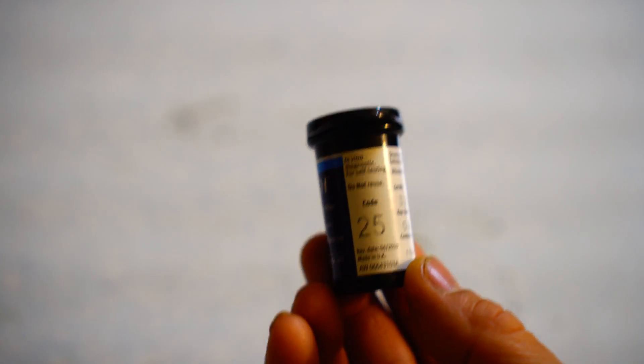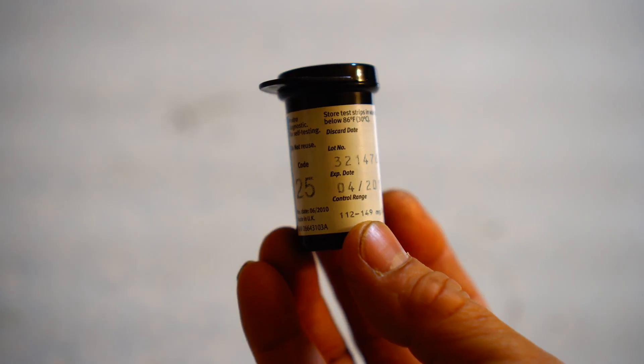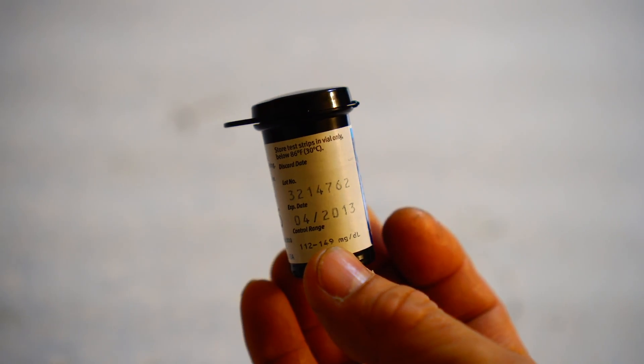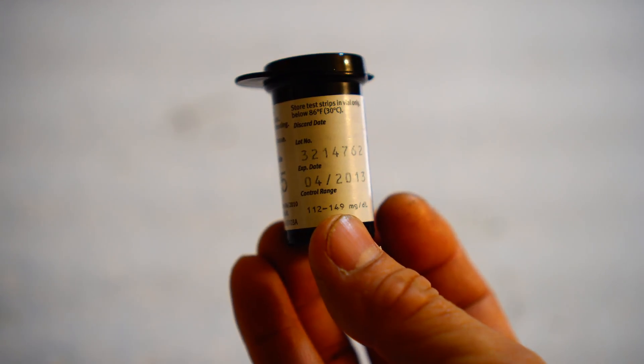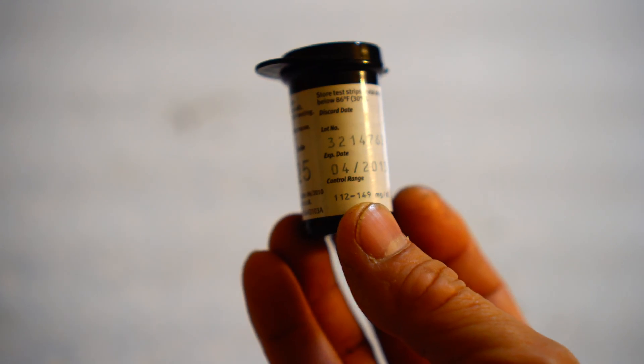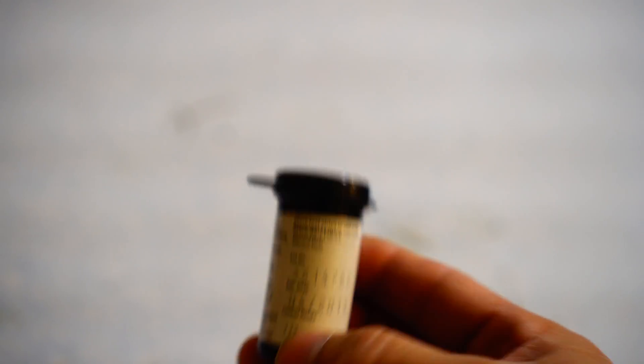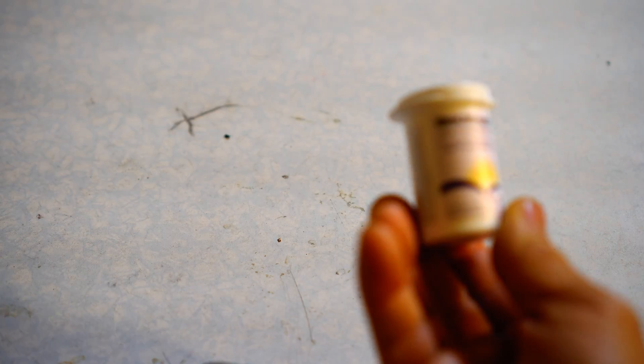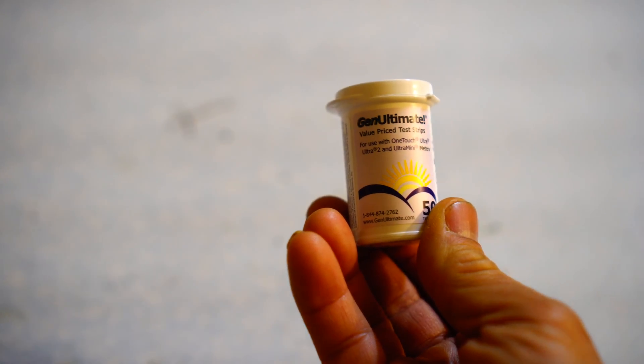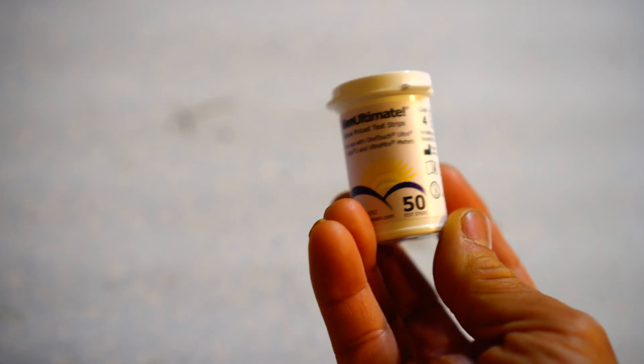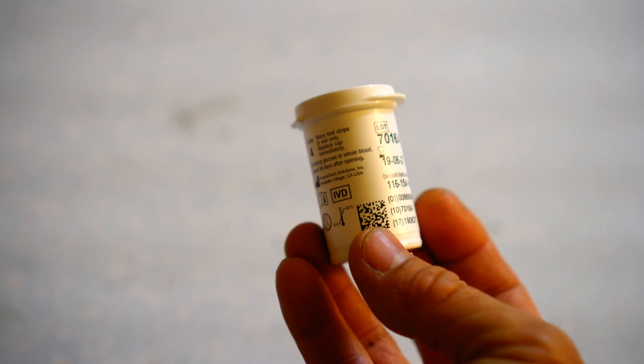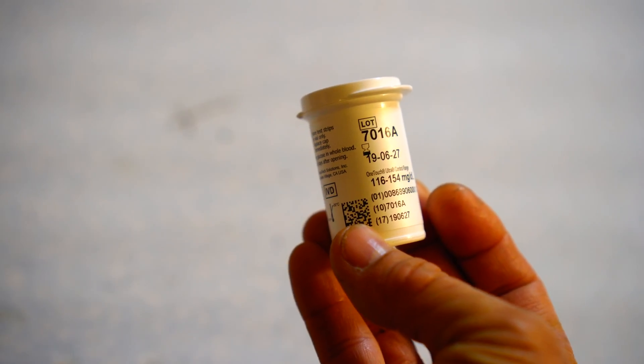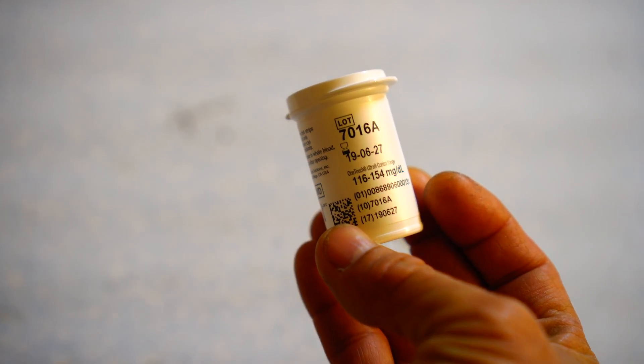I'm going to run the test against this LifeScan One Touch, and then I'm going to run some tests against this strip that you can buy from Amazon. They're about a third of the price of the One Touch test strips.